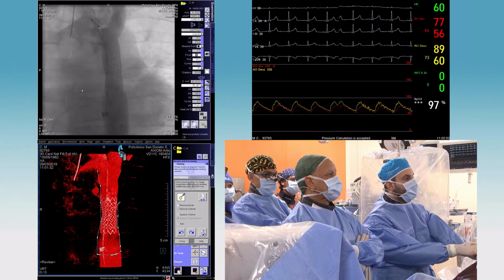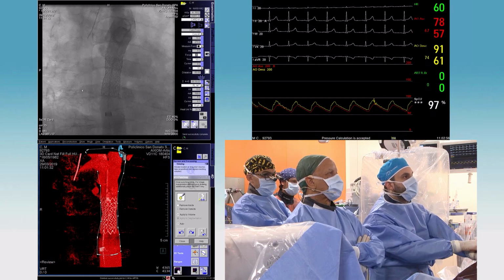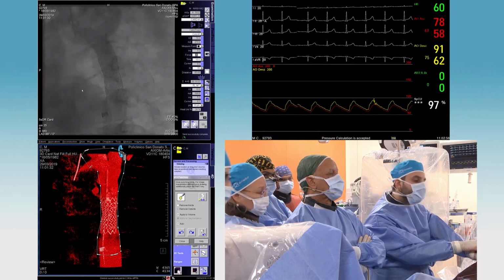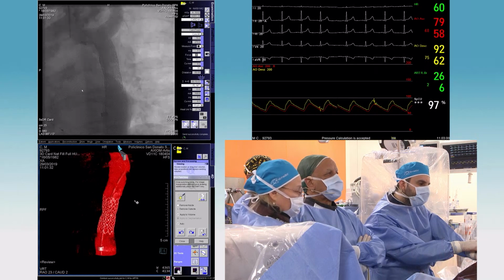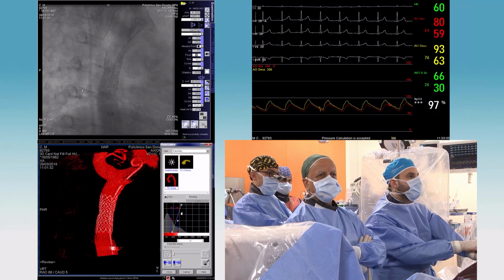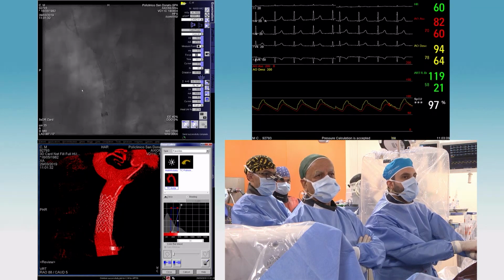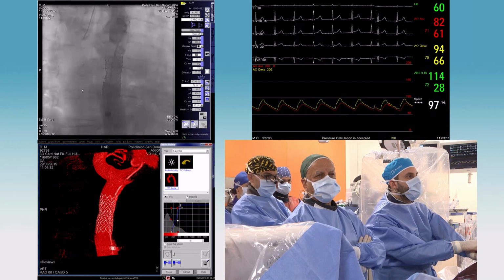Oh, it's really nice. Have your technicians do the post-processing? Yeah, they're doing it at the moment. Can you see that now, at the bottom left? Yes, we can. All right. Any other questions?